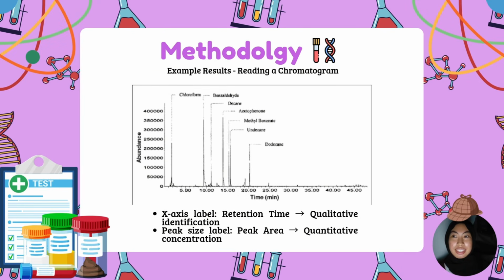So what does the final data look like? When those separated chemicals cross the finish line, they hit a detector, creating a graph called a chromatogram. We read this using two main clues. First, retention time: how long the chemical took to pass through the column. Since every drug has a signature speed, this identifies what it is.